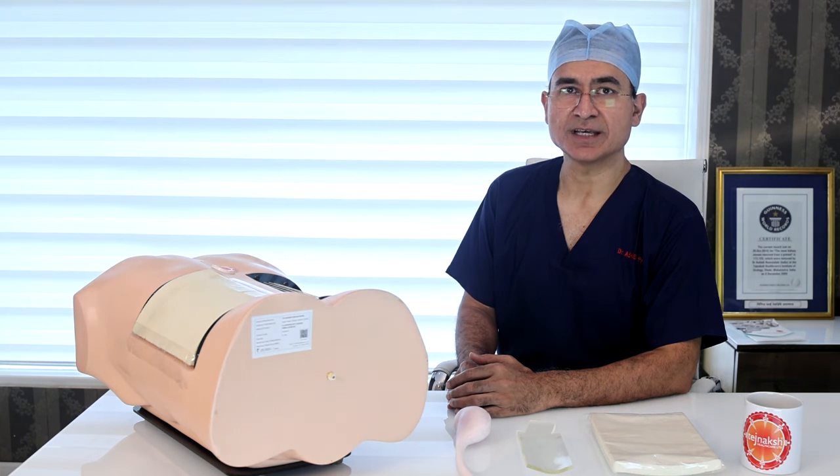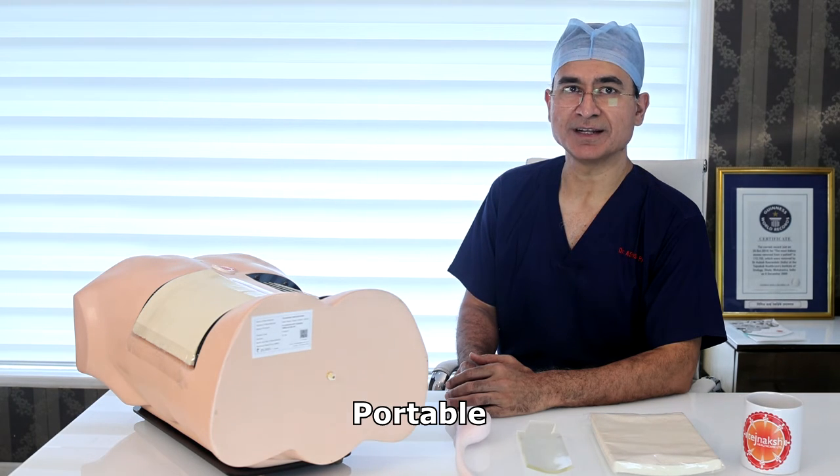It replicates exact tissue haptics. The needle has a very smooth insertion and allows the trainee to practice needle stabilization during puncture. It can be taken to any place which allows screening and practice PCNL.